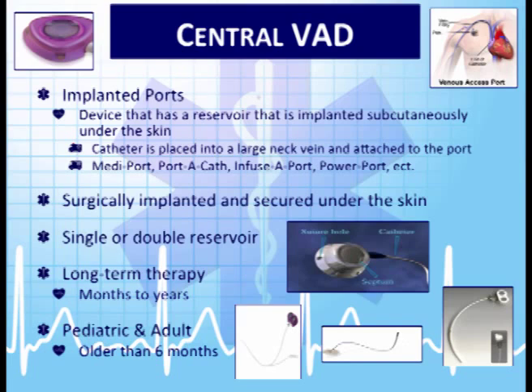Different names, these are not all the names, they might have many different names, but MedPort, Infusaport, power port is a common one that I hear. They can be a single reservoir, or you can have a double reservoir. Okay, and we'll later feel what the difference is between touching a single versus a double reservoir, and that's where we're going to access.